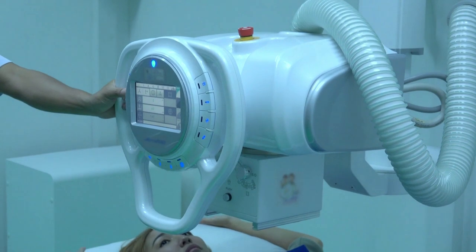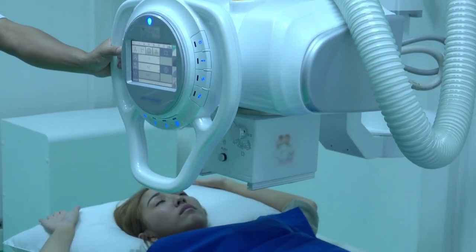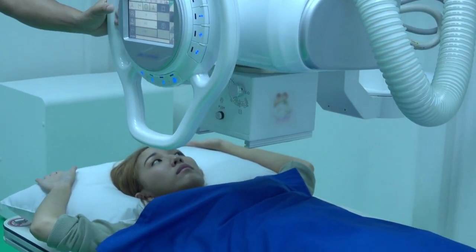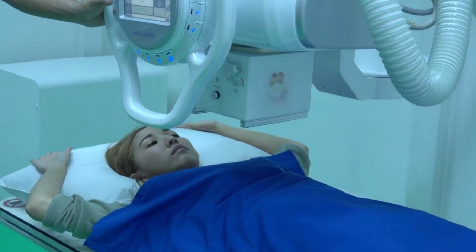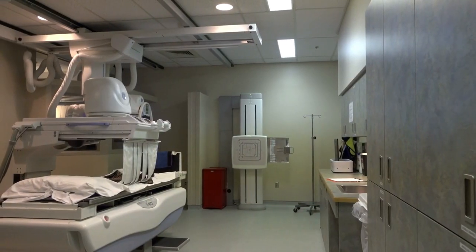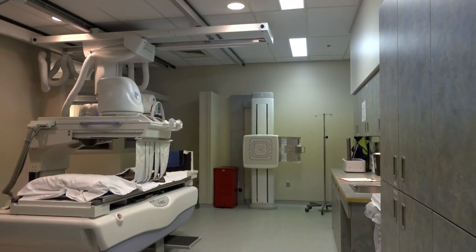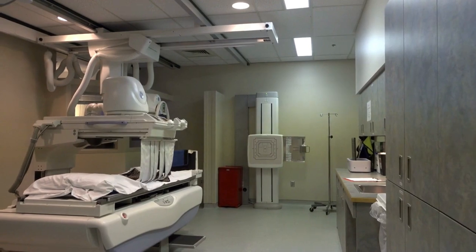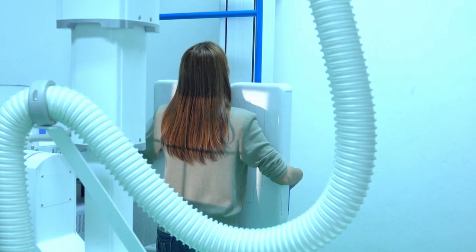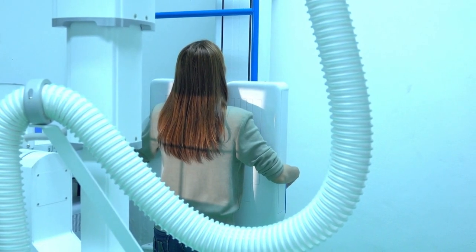The last of these basics is the evaluation of technique. Evaluating the chest x-ray technique is essential to ensure the quality and accuracy of the image. The three critical aspects to assess are inspiration, penetration, and rotation.